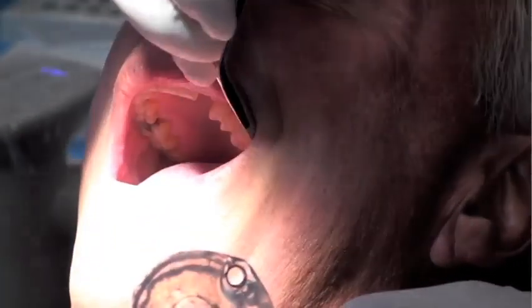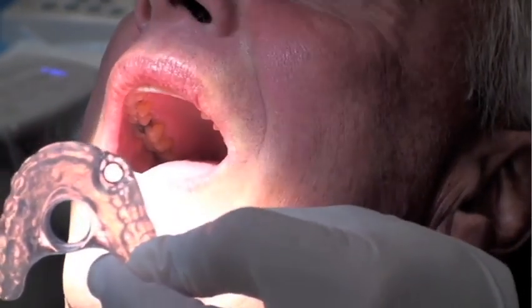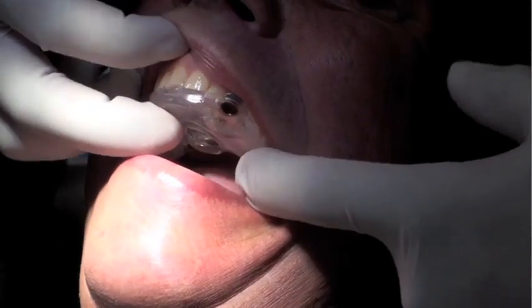At this point we're just verifying the fit, and the beauty of this system is the snap fit that I've been able to get each and every time. You can observe that snap fit here momentarily. There we go.